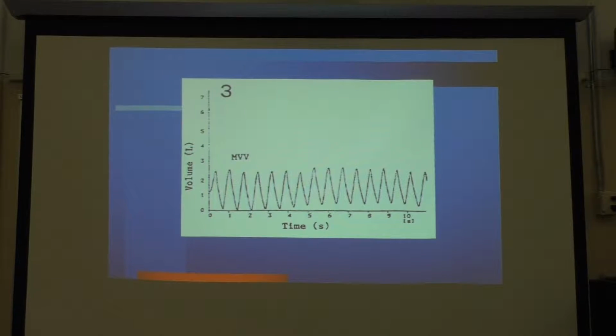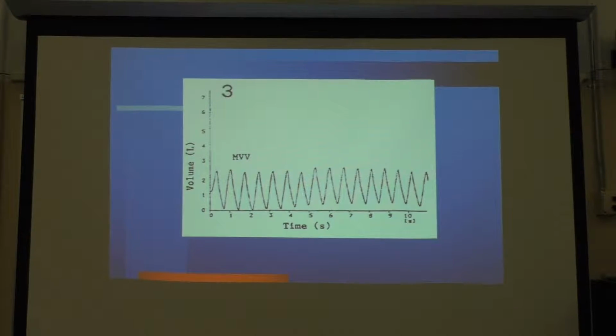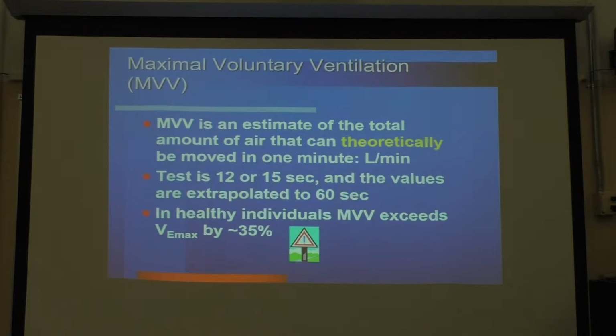And then we assume that the other 48 seconds are essentially at the same rate as that first 12 seconds, which is a huge assumption to make. And therefore, this is a theoretical variable. But it also has clinical significance.